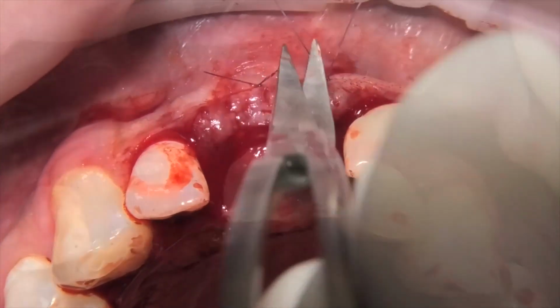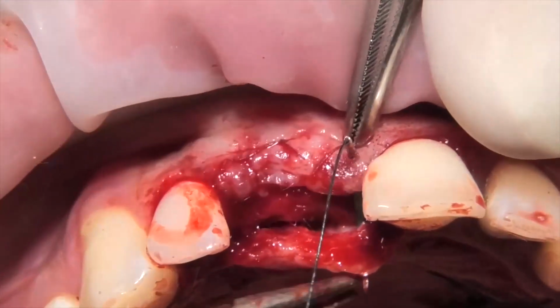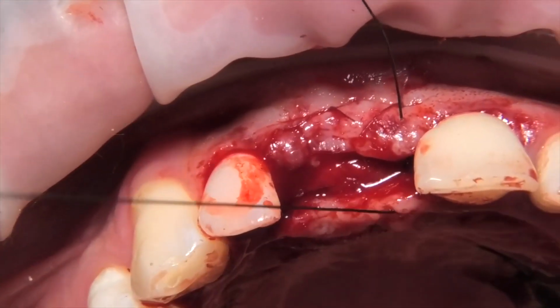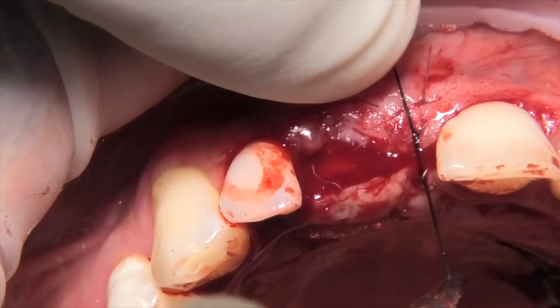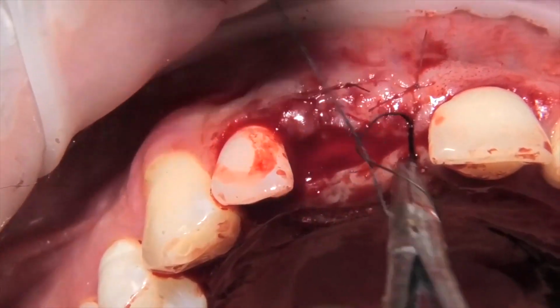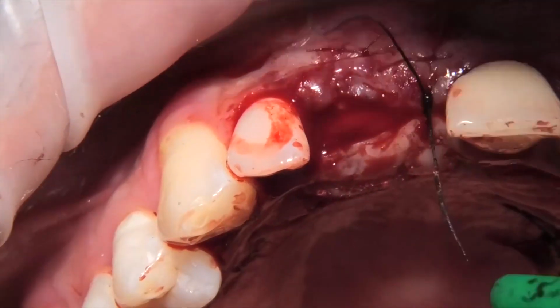And so at this point, the suture between the vestibular and palatal flap is completed with 4-0 single sutures in pseudo-monofilament. And the closure of the flap is without tension because we relaxed the flap with the periosteal incision.